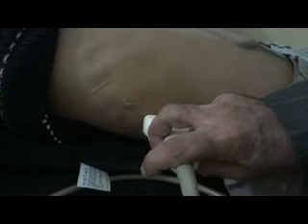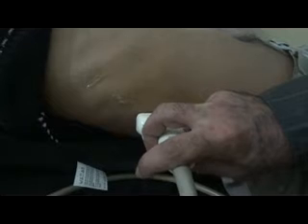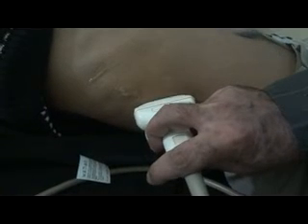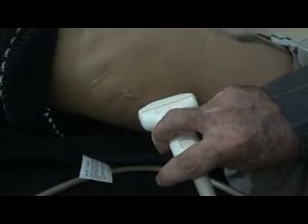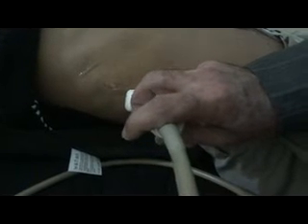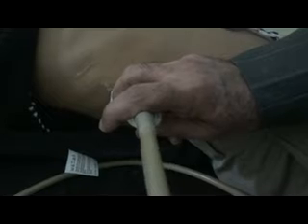Place the probe — first the patient is fine, and then I am placing the probe in the intercostal region at its lower end, only slightly maneuvering the probe in this way. Asking the patient to take a deep breath and hold it.